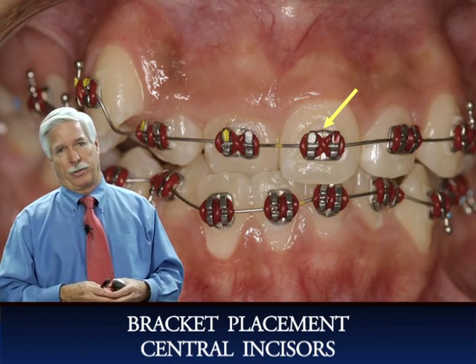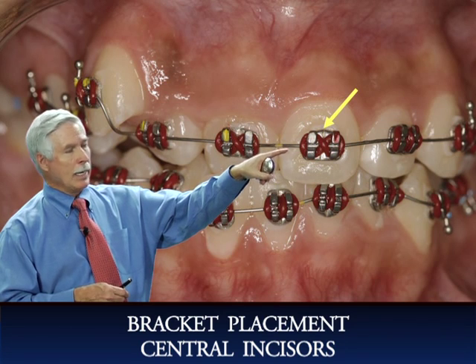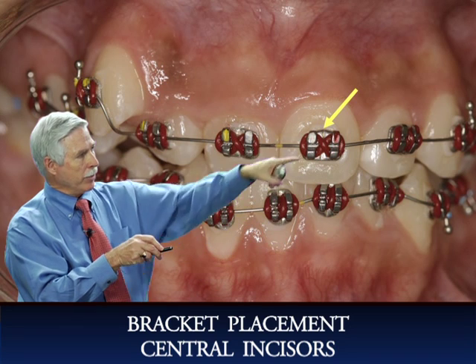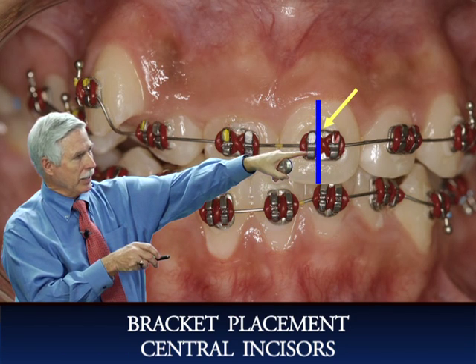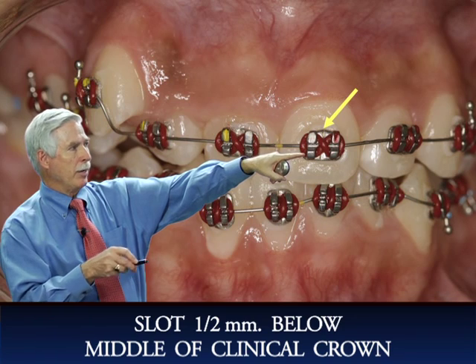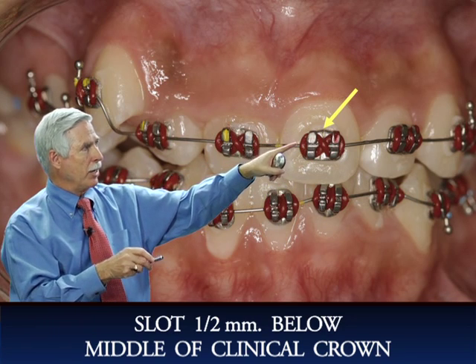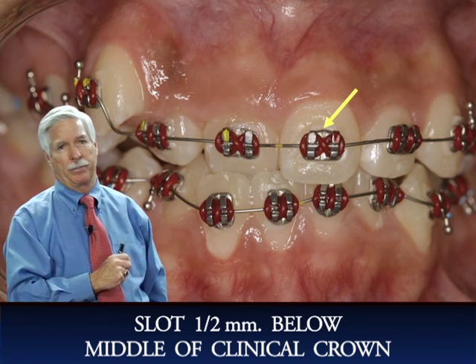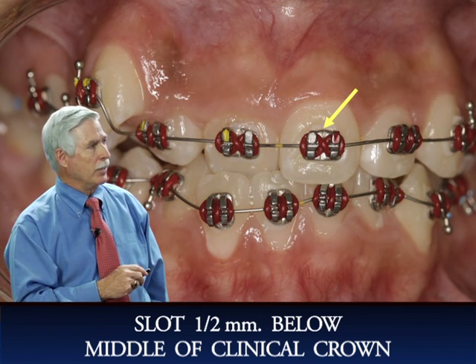Now, bracket position. Remember I told you, when we're placing brackets, rule number 1 was to measure the distance from the gingival margin, as you can see here, gingival margin to incisal edge, and then the slot is 0.5 millimeter below the middle of the clinical crown. And you can see the bracket placement in the central: the slot is 0.5 millimeter below the middle of the clinical crown. So that bracket is placed correctly on that upper left central incisor.